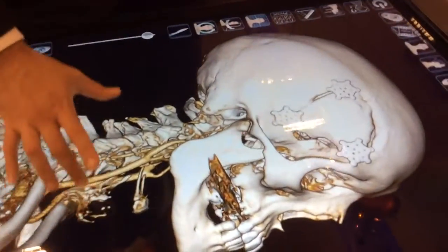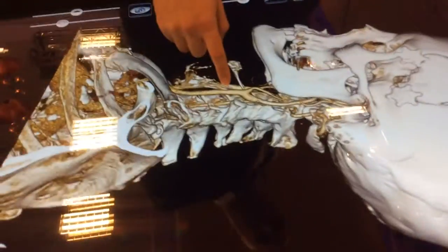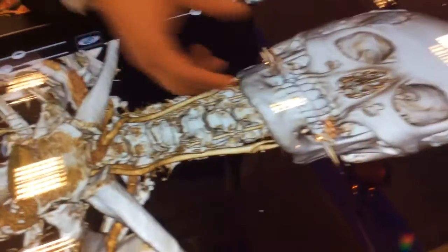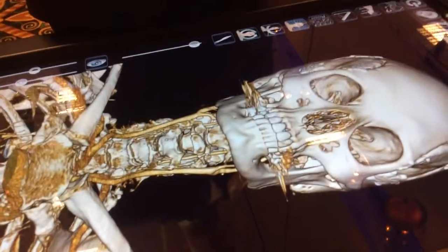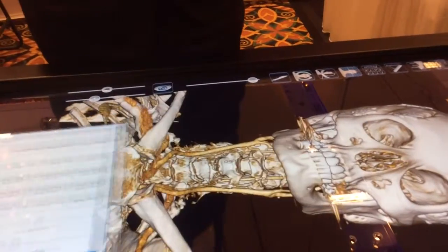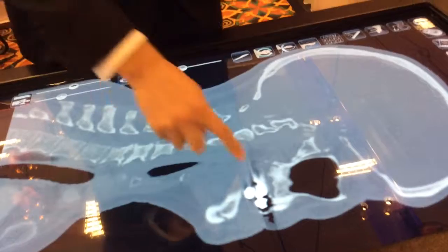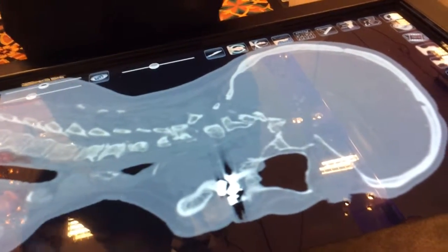So here, this was a post-op scan for an aneurysm clip surgery. And what are these gold parts I'm looking at? That's blood vessels. And this is scatter from the fillings in the teeth. Really? So there are just digital artifacts, basically. Actually, not digital, but even if you go into the original slice data here, you can see that even if they were just looking at the raw slice data, they'd still see this scatter. So there's not much that we can do about eliminating it.